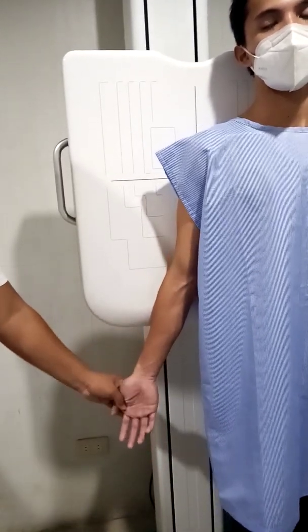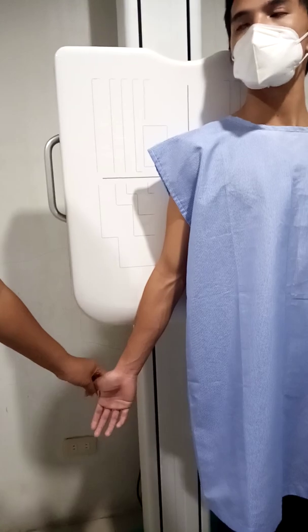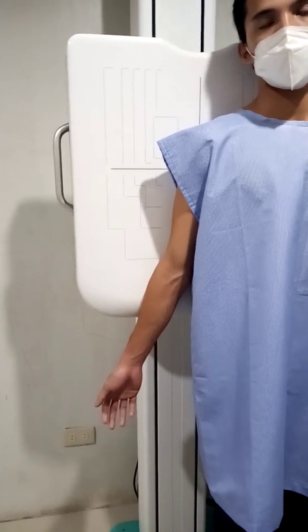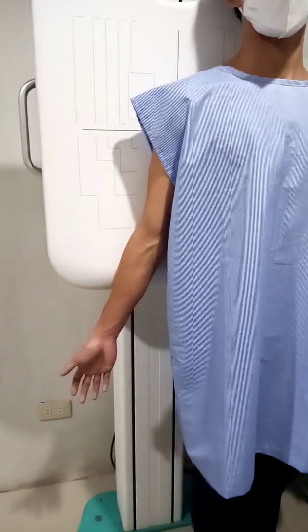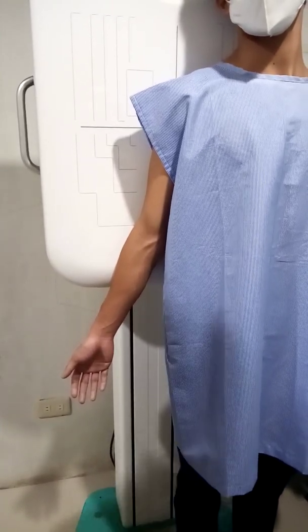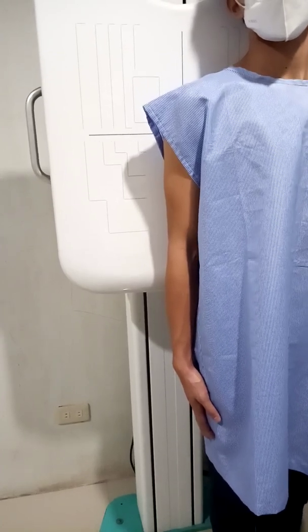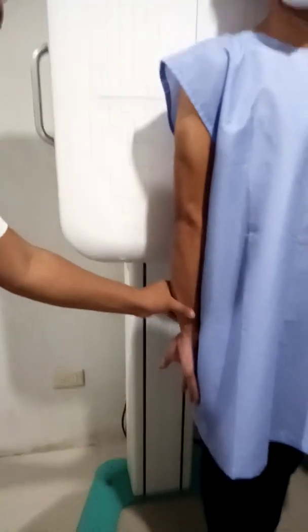That's one. If the hand of your patient is in a supinated position, then the humerus is in external rotation. And if the palm of the hand of the patient lays against the hip, it will position the humerus in neutral position. The next is, if the posterior aspect of the hand lays against the hip, it will position the humerus in internal rotation. Very good.